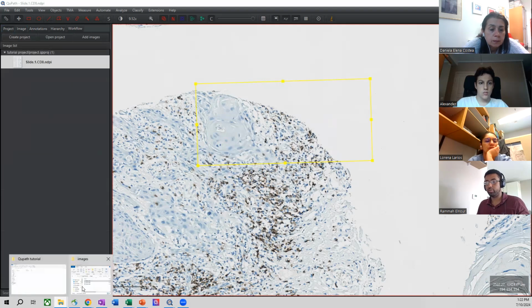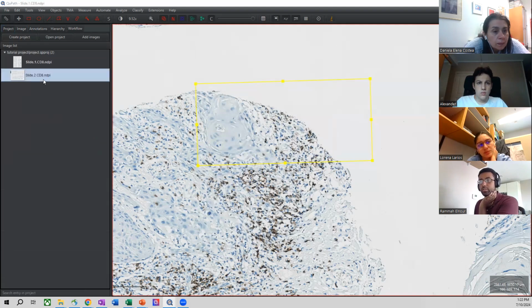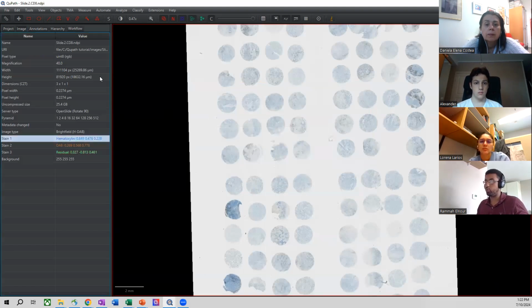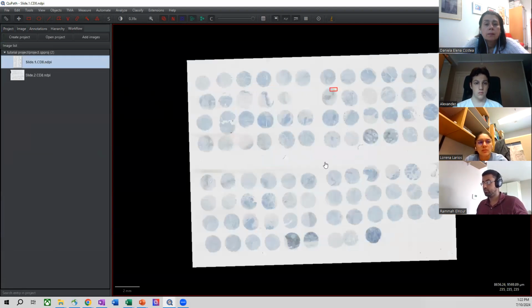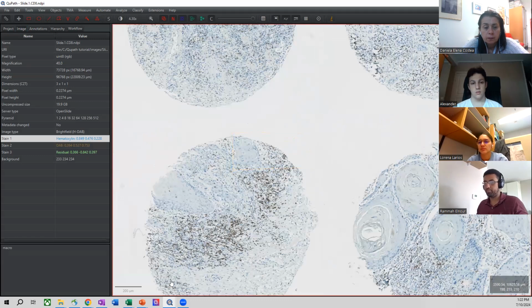So let's say I upload image 2. Import. And then in image 2, I would then manually correct these so that they are the same as in slide 1, right? So I just paste the numbers that I already have from before. So I'm going to go back into slide 1. Great. So now that you have your stain vectors, you can move on to the next step. So I don't need this object anymore. I'm going to delete this.